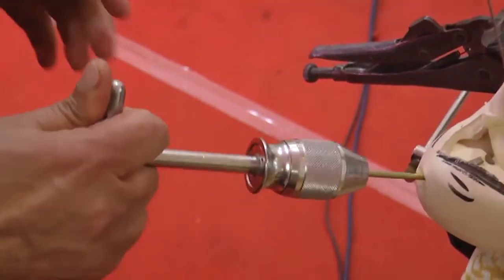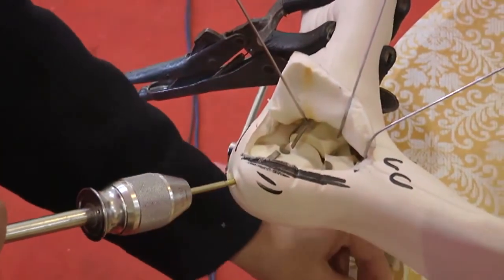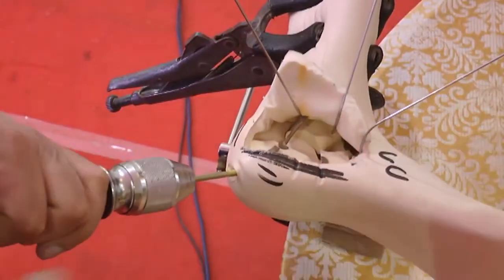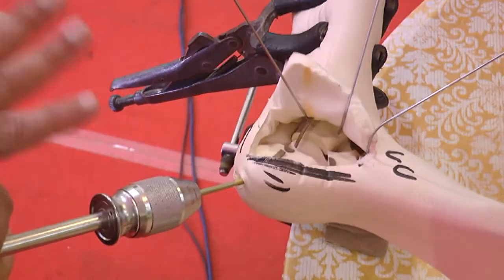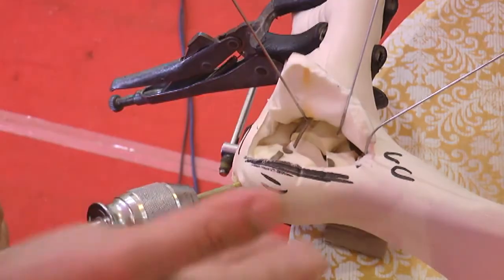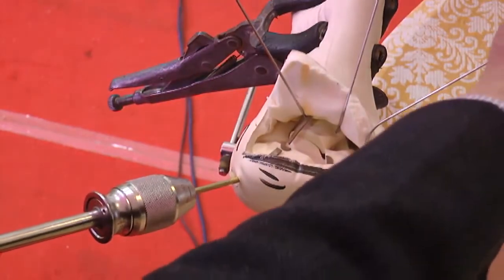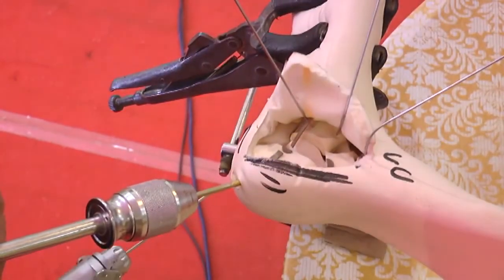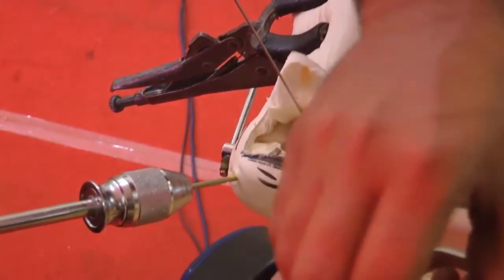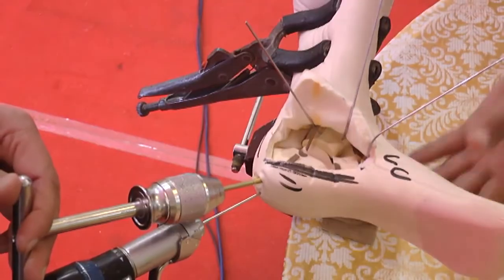So your assistant holds this down and corrects the varus, and you can then put one Steinman pin or two Steinman pins or a couple of K wires, thick wires, and that corrects the heel varus as well as the tuberosity inclination and gives you space for the subtalar joint reduction later on. So this maneuver will align the tuberosity to the medial, to the sustentacular fragment. The medial wall will be reduced in the axial view.